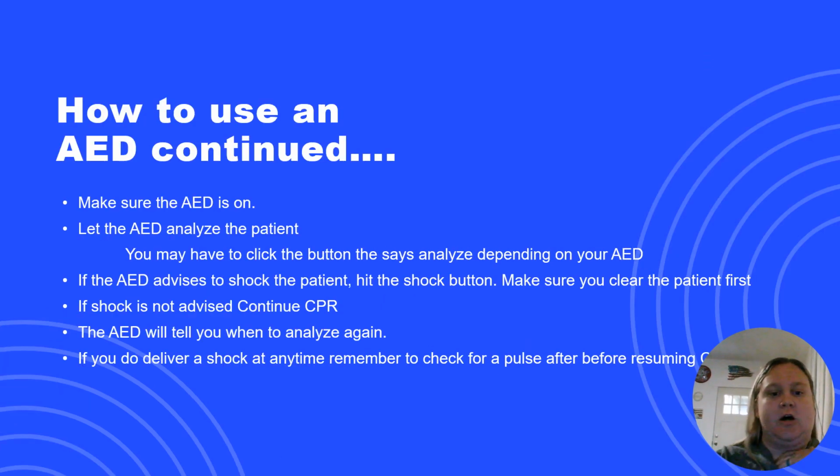All right, so we've done that. We've located the pads, we've got the pads on. So now we want to make sure that the AED is powered on, okay? It's not going to do us any good if it's not on. We're going to let the AED analyze the patient. You may have to click the button that says analyze so that it'll do its thing and analyze the patient, and that's dependent on your AED. If the AED advises a shock to the patient, you're going to hit the shock button.